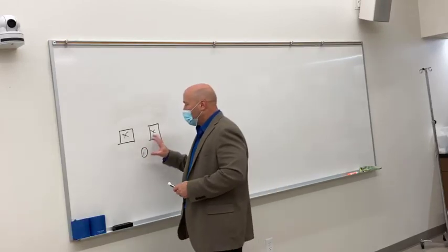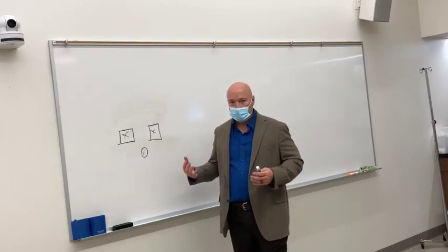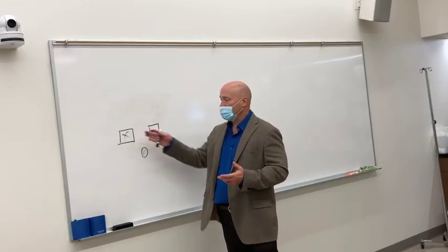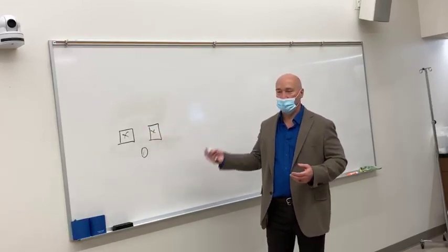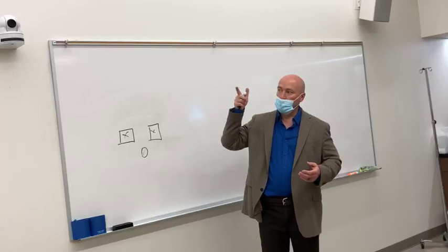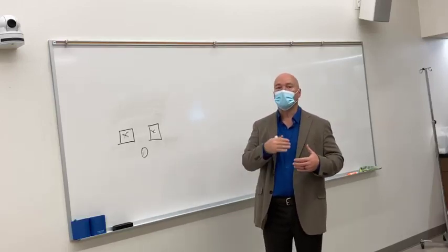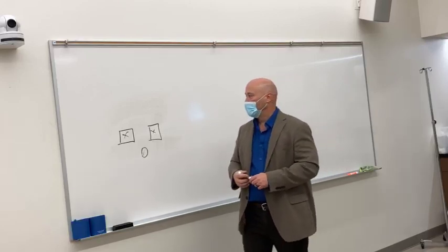So what these things are is basically a counter for radiation exposure. That's all they are. You make an exposure, and these things have a preset amount of radiation that they should receive. Once they do receive it, you're going to send a signal over to the timer circuit to discontinue the exposure. Remember, your timer circuit is what kills the exposure. That's what triggers the exposure to stop.